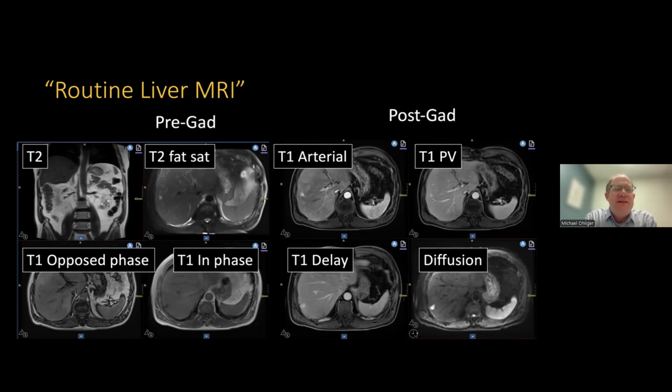Now, the way you usually diagnose pancreas cancer or assess the pancreatic duct is through dilation of the pancreatic duct. And actually, CT can see the pancreatic duct really well. It usually sees a dilated pancreatic duct very well, whether it's a benign cause or a malignant cause. And so that's pretty good. So the pancreas protocol, unless it's really for cancer staging, is just extra radiation, especially in someone with pancreatitis or something else. It rarely adds anything.